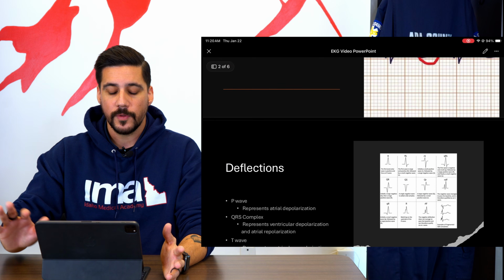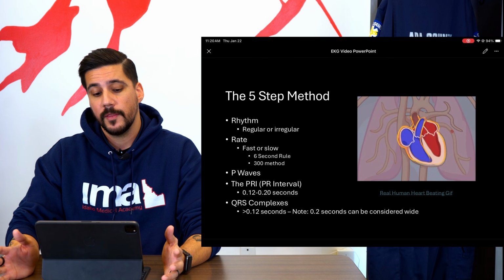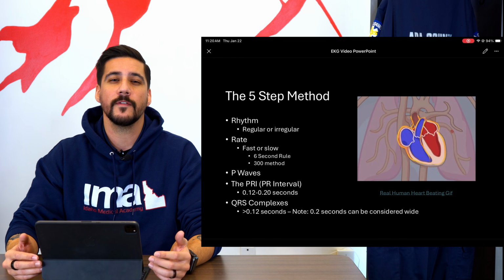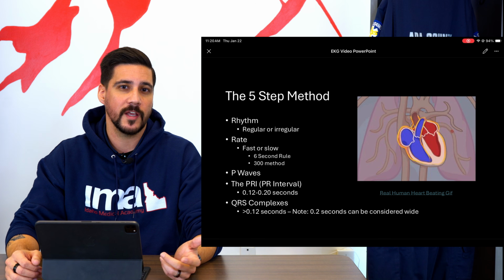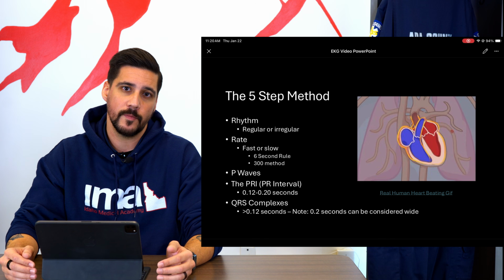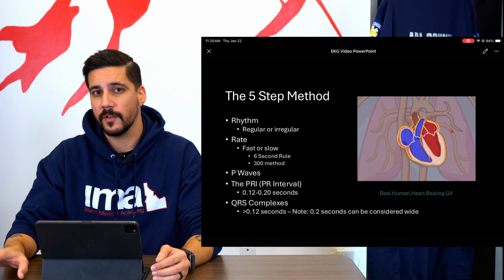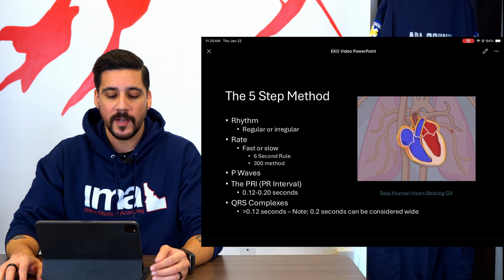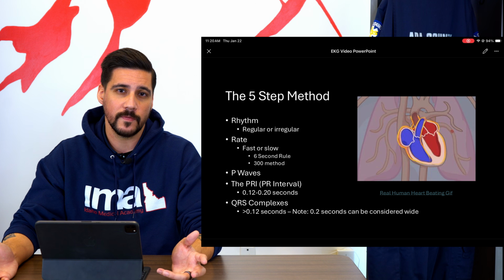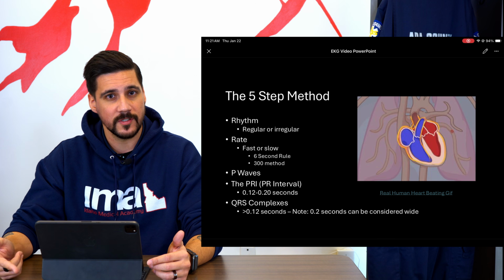Okay, so those are going to be the basics of just kind of EKG interpretation. That's just the tip of the iceberg when it comes to this, but it is a good starting spot. This is something, if you're interested in becoming a paramedic, becoming an EKG tech, maybe even med school, nursing, depending on the profession, this is something that you need to be familiar with. So this is not something that, if you're at the basic scope, will necessarily be tested on like the NREMT exam, but it is something just maybe to keep in mind. And maybe it'll help you as you're starting to figure out the electrical conduction of the heart anyway. It'll help you kind of figure out, okay, this is why they're looking at this, this is what they're seeing.